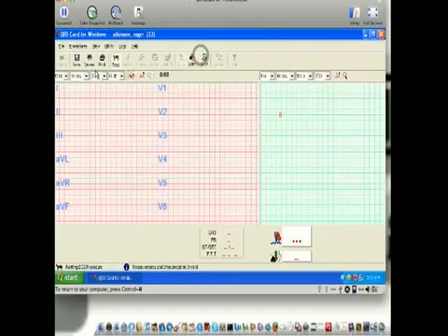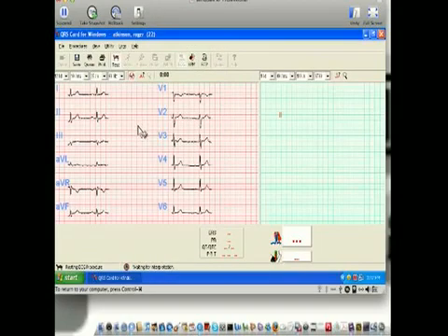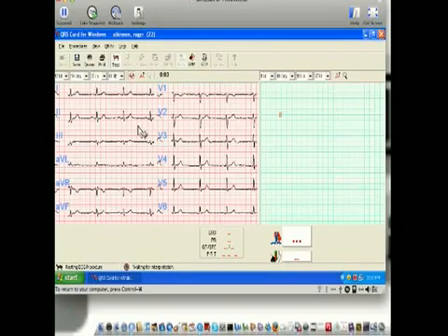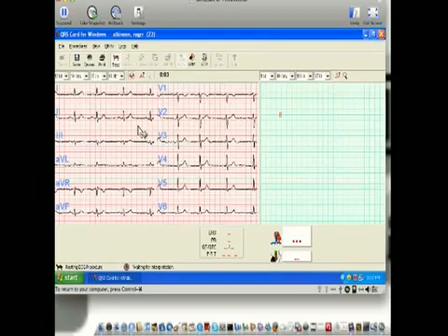Okay. Your EKG leads are hooked up. This should go through. And this looks like a good reading, Roger.